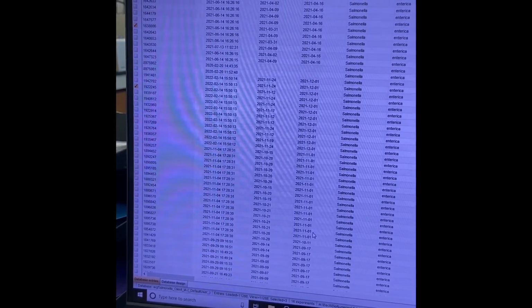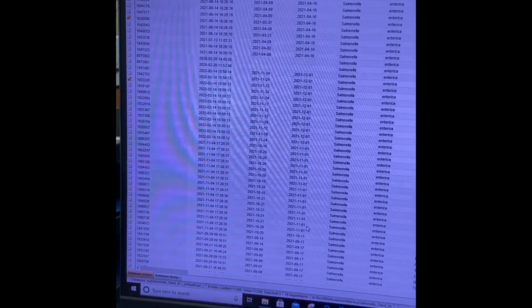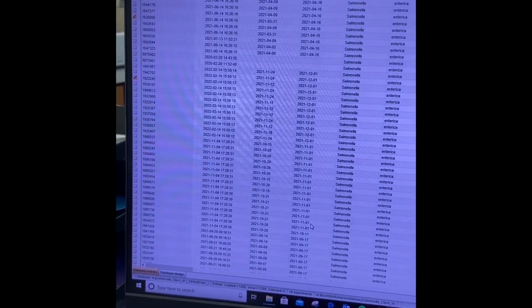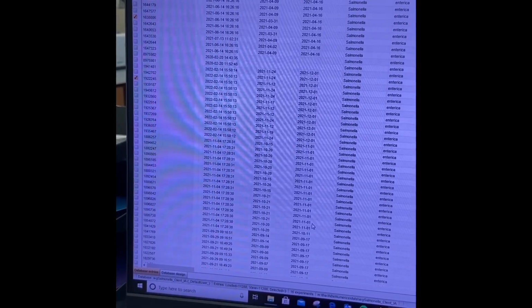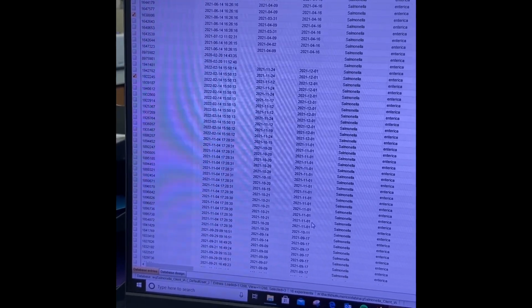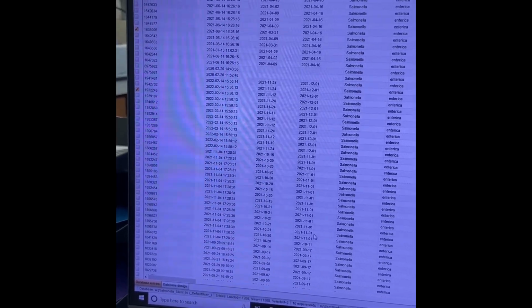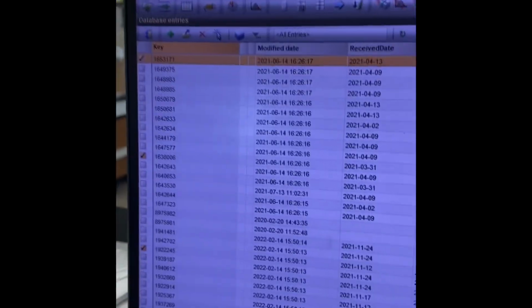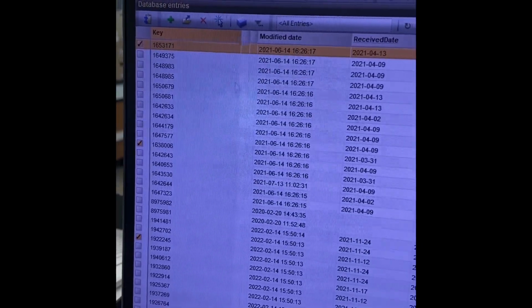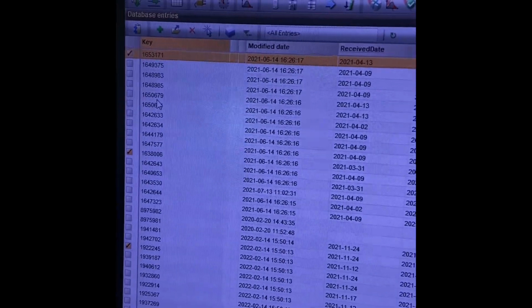Our files do go into an initial database called a RefID, and then after we do some calculation and species identification, we go into an organism-specific database, and this database shows our Salmonella database. So you can see we have our unique keys, the accessioning numbers that have been assigned to our sample from the moment that we received it.